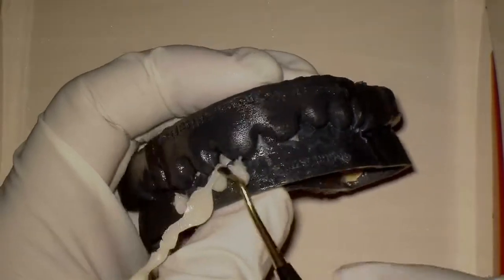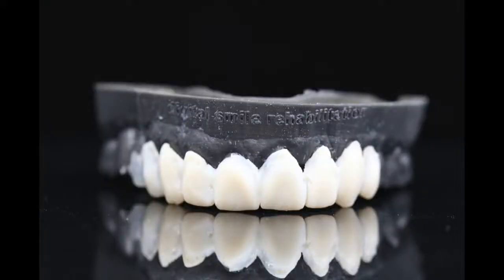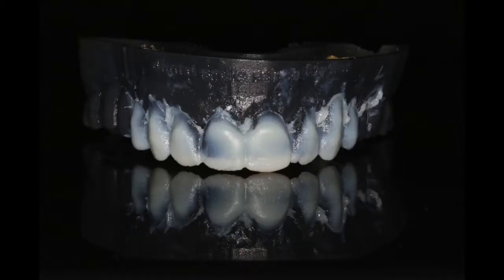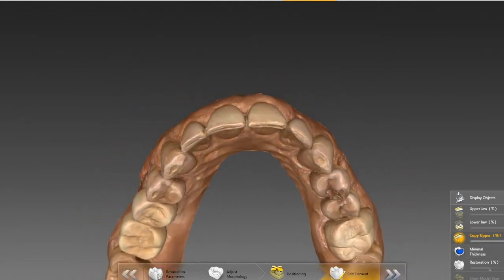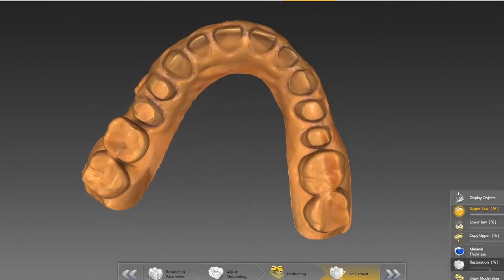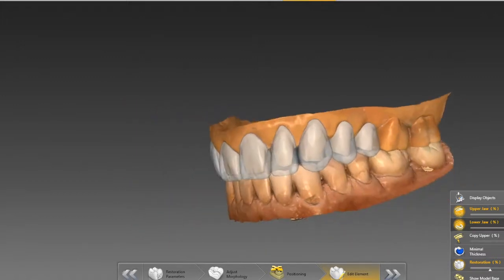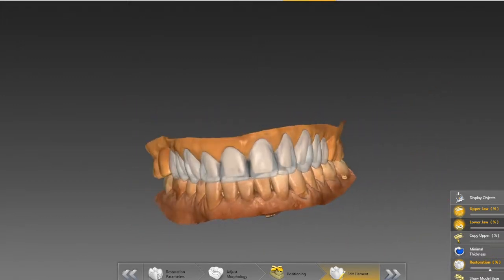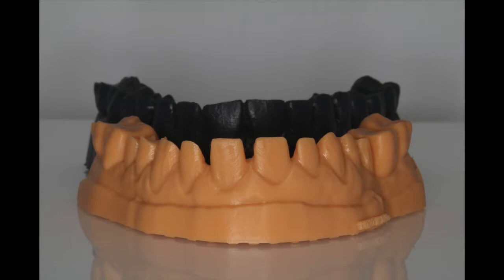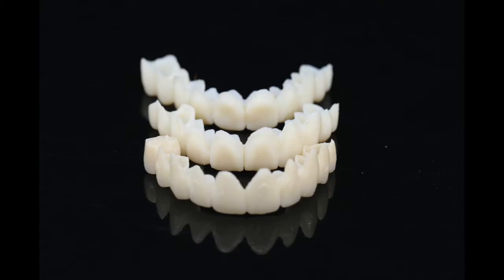But when you're trying to move teeth further in, lingually, or make them shorter, you have to prep the model either manually or virtually, otherwise the mock-up becomes too thin. Now these can only be tried in on the model or after the initial tooth preparation. The matrices fit on the pre-op and the virtual prep model. You get multiple sets made up, and you can try them in the mouth.